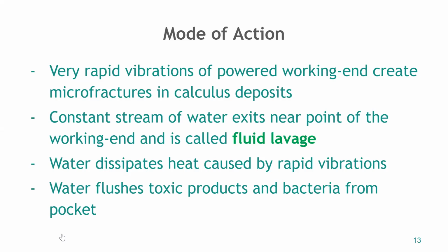If we don't have enough water, then our tip is going to get hot or even warm. So it's important that we have enough of a water spray to keep that tip cool. Otherwise, especially if you're doing root instrumentation, it's going to be really sensitive if it's too hot. And then water flushes the toxic products and bacteria from the pocket, like I had talked about.